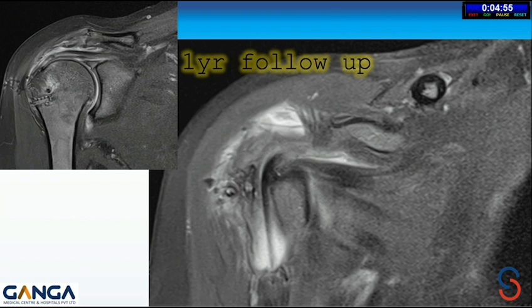This has not been classified. If you see, there was bare bone, and just that small tendon tissue was there. So the cable was completely damaged there. But it ran all the way to the front. I don't think it was too much, but there was a remnant there still. Whatever tissue was there, we preserved it, just passed the sutures, and then took the same sutures into the medial stump and then did the lateral row repair.